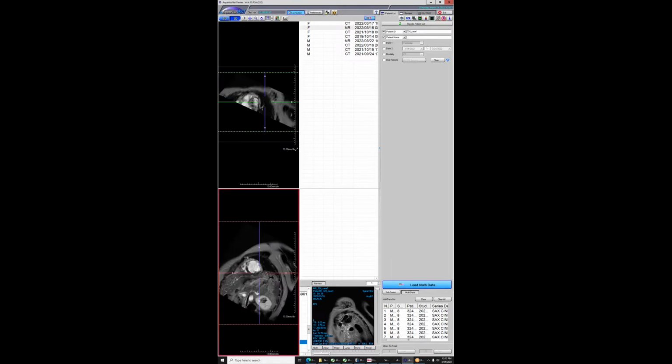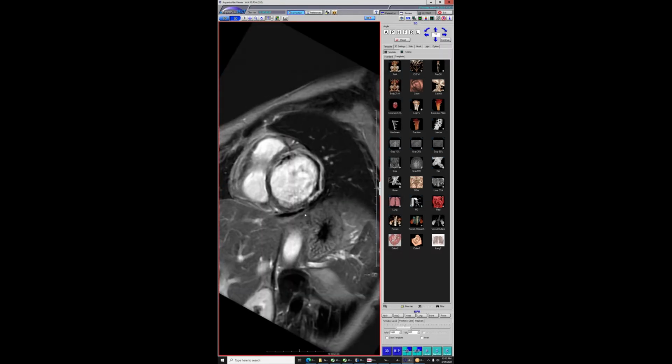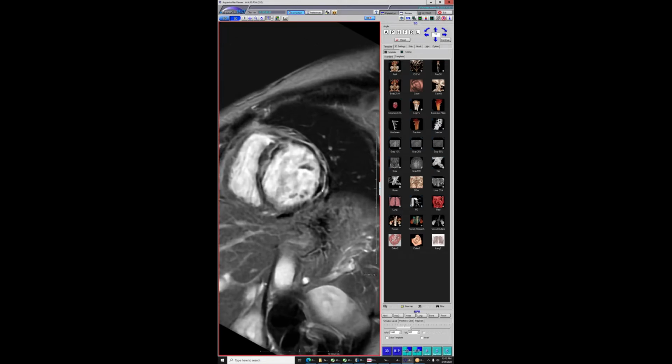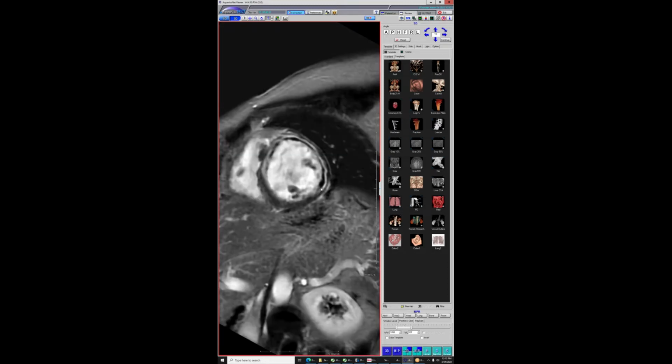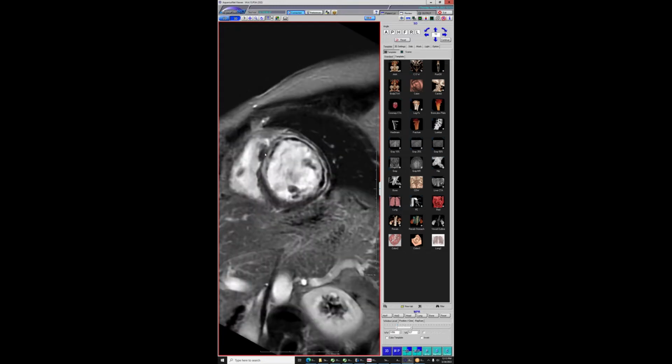So this is her delayed enhancement sequence, and it's always bad when you have infarct and you have no contrast within the areas of infarct. This is infarct that's enhancing around the edges. One of my residents got fooled, thought this was some sort of non-ischemic process because of the enhancement in the mid cavity going to the epicardial layer, but all this is complete black in the subendocardial layer. So this is a case of really horrendous microvascular obstruction. The subendocardial layer, which is the most severely involved, is so edematous and filled with hemorrhage that gadolinium can't even diffuse into that area to show any enhancement.